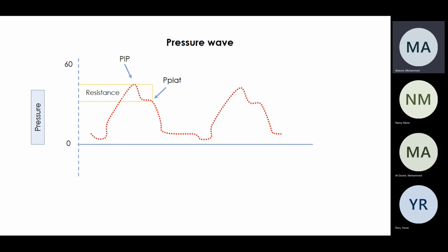So we said resistance. That's right. Driving pressure is not from these two numbers, but resistance is. So resistance, why do we care about resistance? Sometimes you have to change the circuit. Sometimes there's kinking of the tubing.